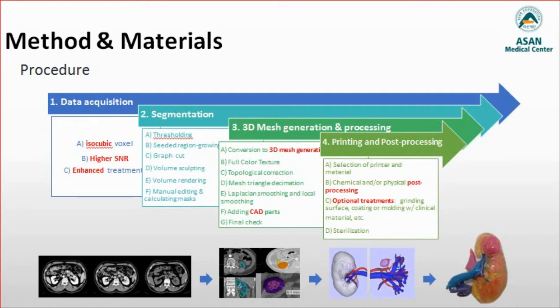After segmentation of a 3D model, the most suitable 3D printer for the application needs to be chosen among various kinds of 3D printing techniques. The 3D model file is uploaded into the 3D printer. The 3D printer uses layer-by-layer stereolithographic accumulation to fabricate the 3D physical model.